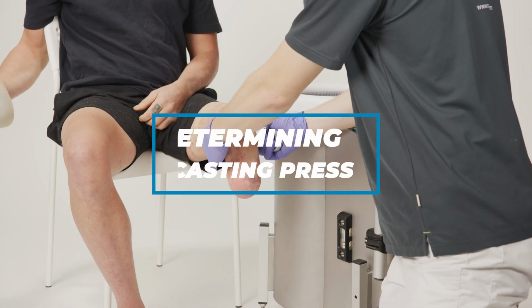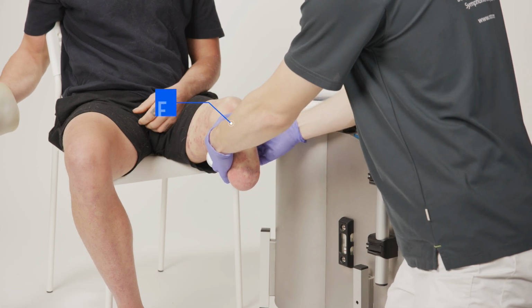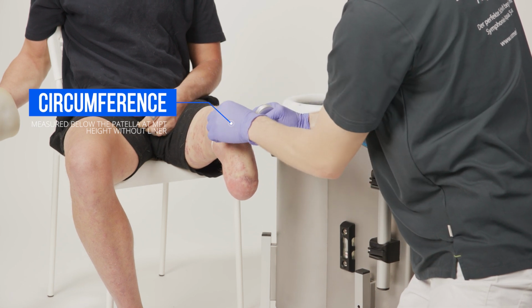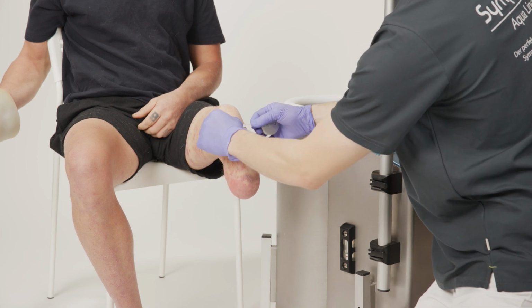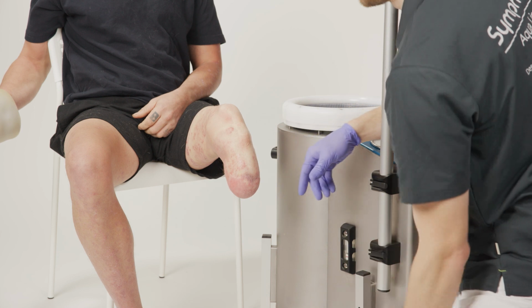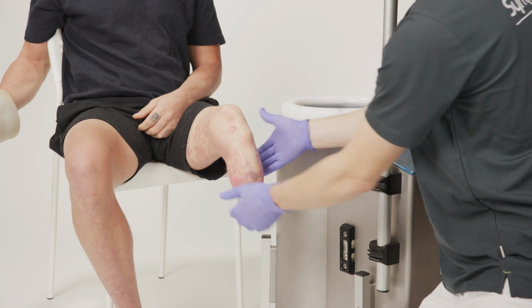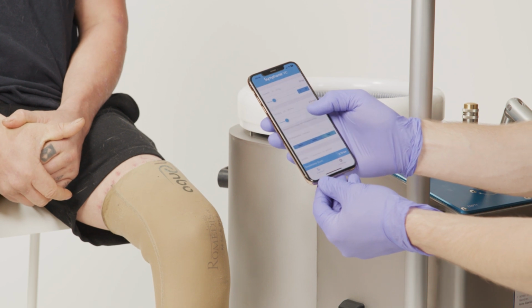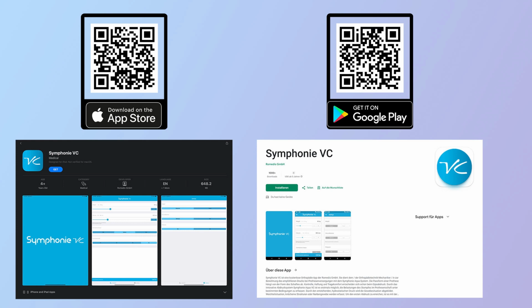Determine the optimal pressure with the help of the Symphonie Aqua VC app. For this, you need the circumference below the patella at the MPT height, without liner on the skin. The condition of the connective tissue, soft, medium or hard, as well as the athleticism of the patient, where 1 stands for unathletic and 4 for athletic. You can download the Symphonie VC app using the QR code. It is available in the App Store and Google Play Store.